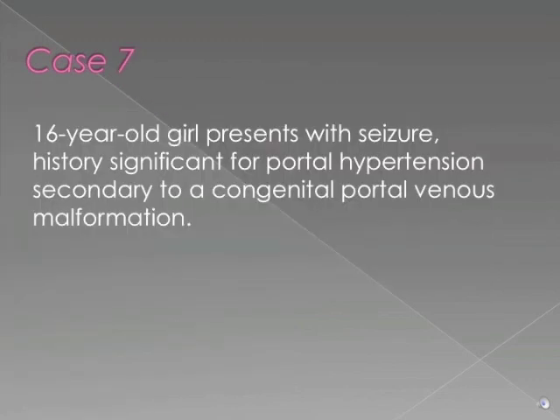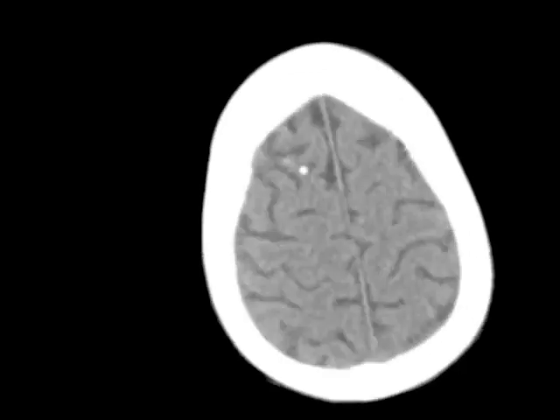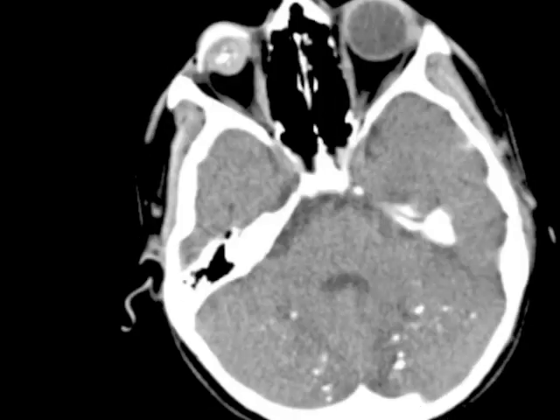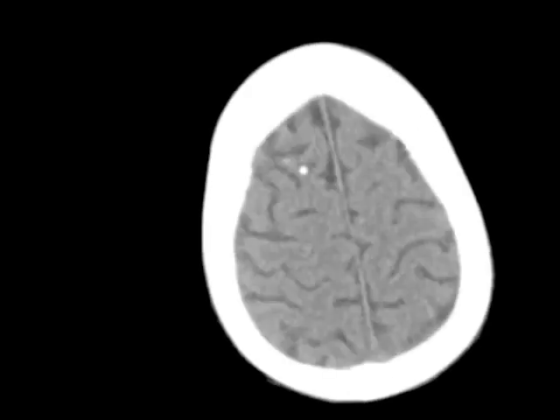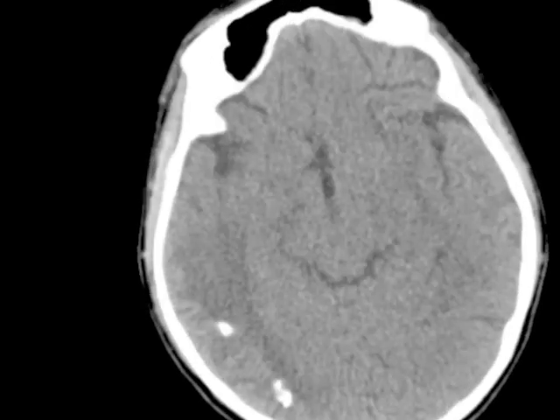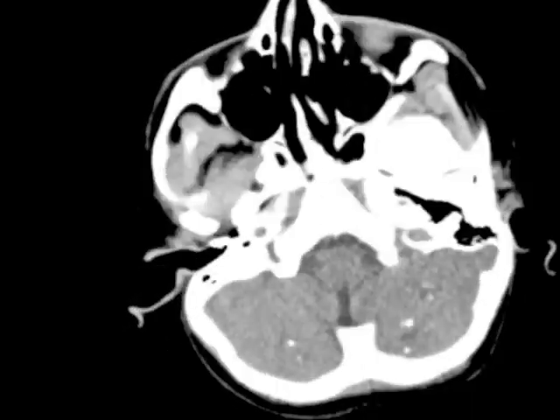Case 7 will be our final case. A 16-year-old girl presents with a first-time seizure. Her medical history is significant for portal hypertension secondary to a congenital portal venous malformation. These are images from the patient's head CT scrolling from top to bottom. We see calcifications in the parenchyma, in the periventricular regions, the basal ganglia, and throughout the cerebellum.